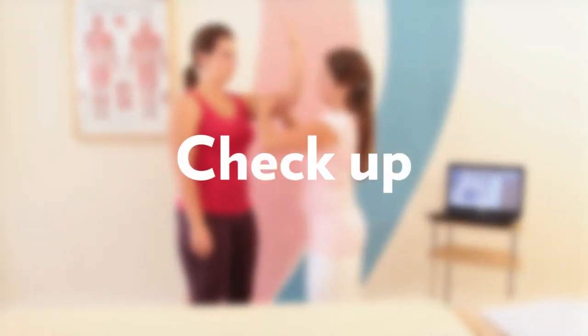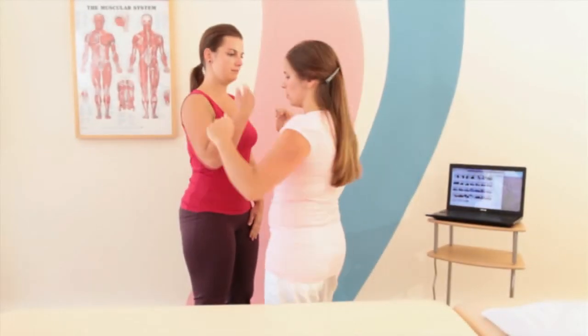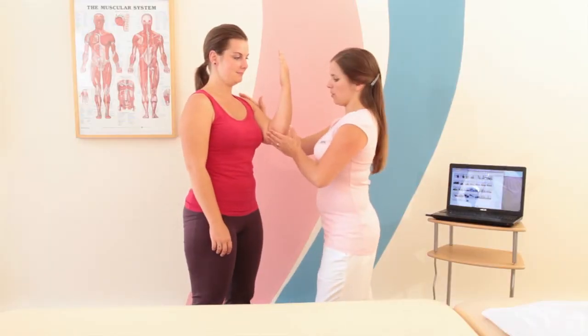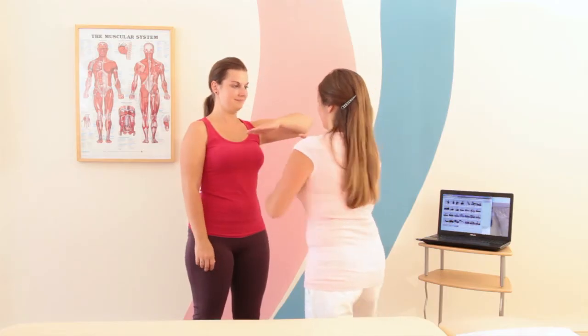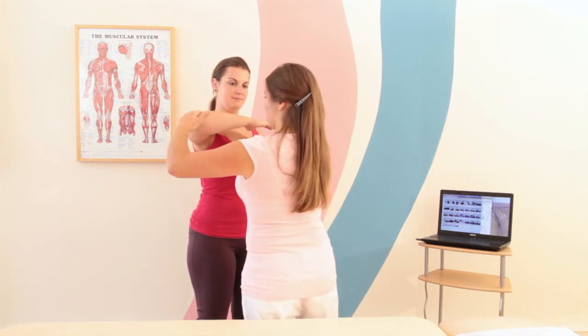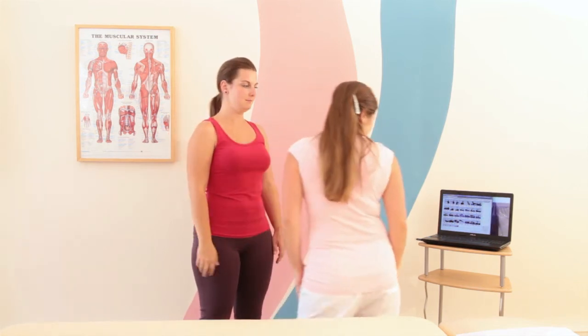Checkup. After each completed physiotherapy session, the physiotherapist performs a check of the myokinetic activation of the muscles that were identified as abnormal. These positions are displayed in the MFK EXPERT System. This allows the client and the therapist to gain an overview of the effectiveness of the chosen therapy. Additional visits are always determined by the current state of the patient, and only one visit is planned at a time.